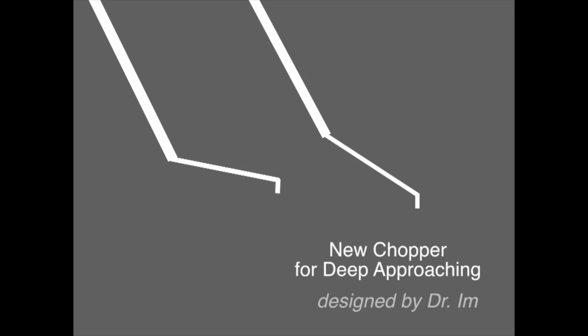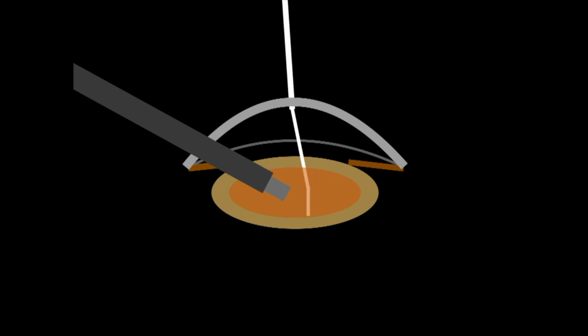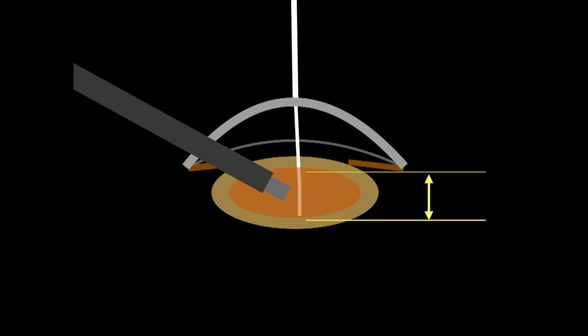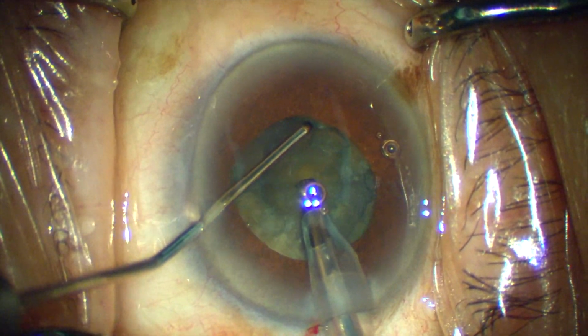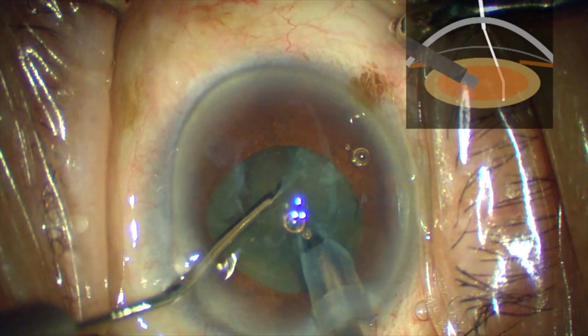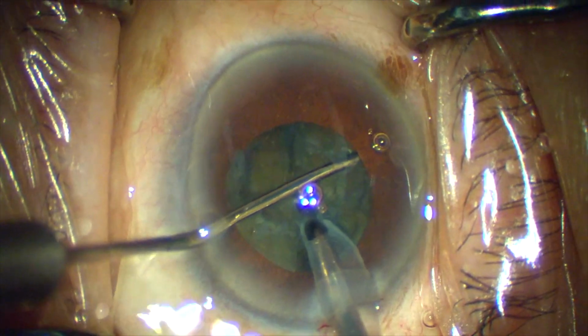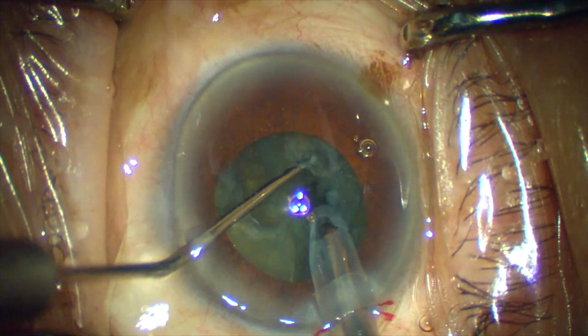The new chopper has more obtuse angle of neck and tip, and the tip is angulated outward with three-dimensional design. This different design makes vertical orientation of the chopper tip to the posterior pole. In phaco chop, this chopper slides to the lens equator very easily thanks to the outward directed chopper tip. You can approach more deeply into the lens posterior with the same technique you have used before.